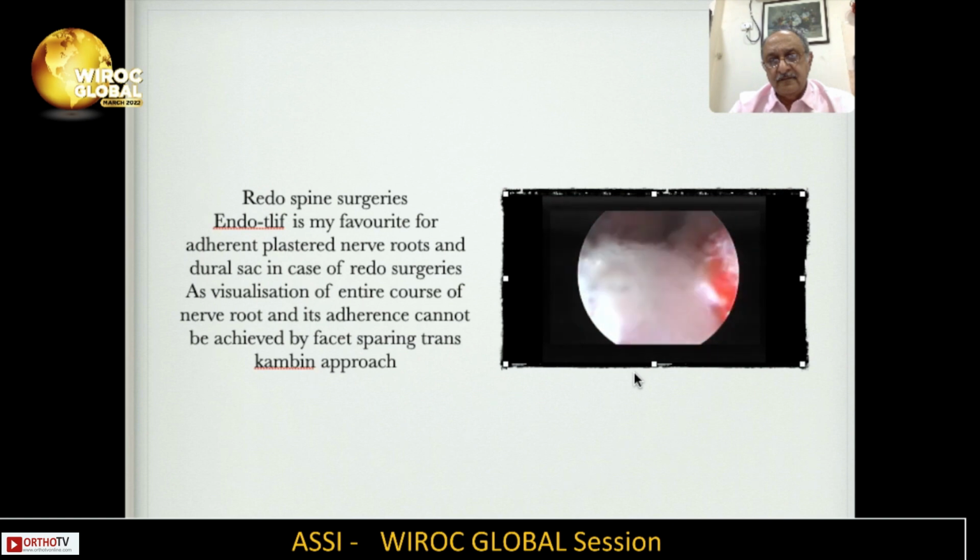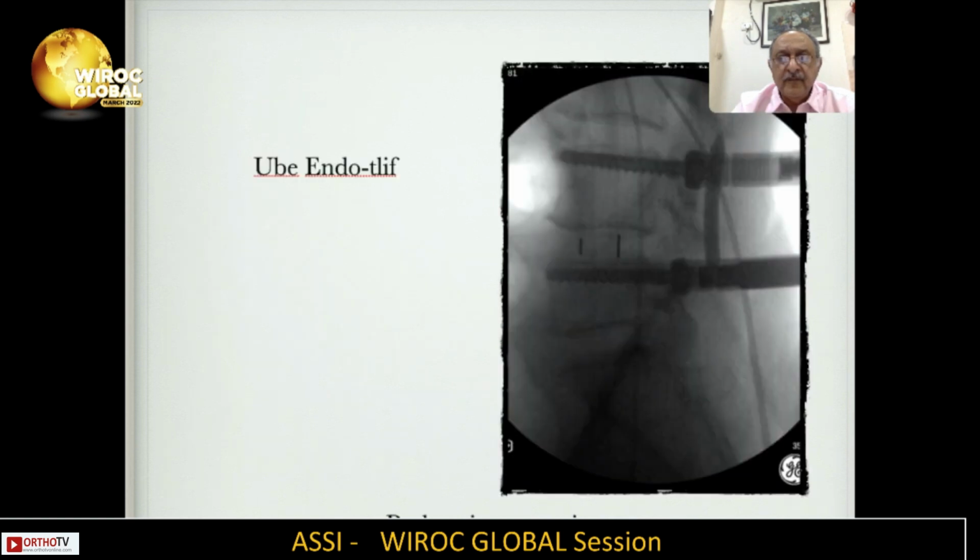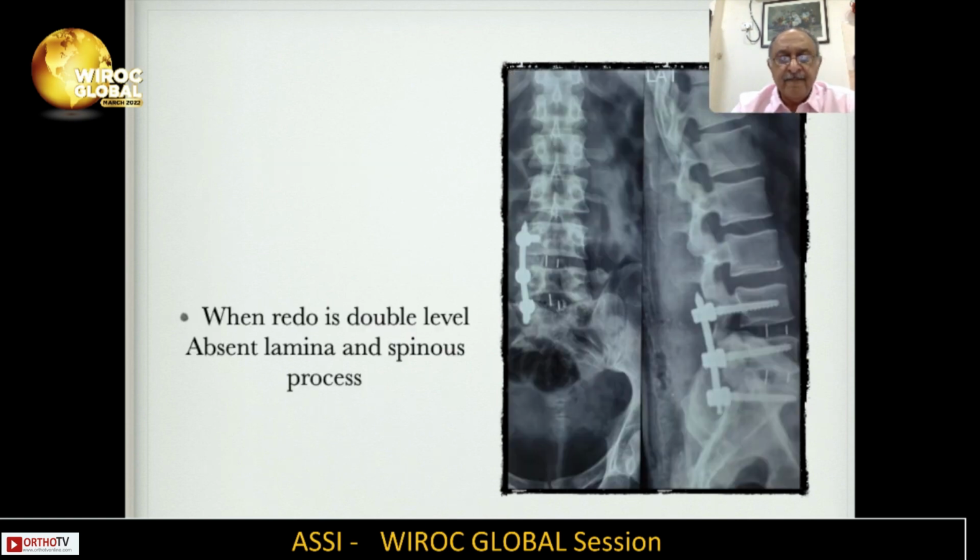Here you can see how with a dissector and pushing away the root and identifying the discal surface, which is barely a millimeter across, getting into the discal zone and pushing away the root which is plastered to it completely. Now this would not be possible by a transforaminal approach and would result in unnecessary traction on the root at the time of expansion by a cage. You can see the result of the surgery. There's a nice fixation in place and a complete decompression done.